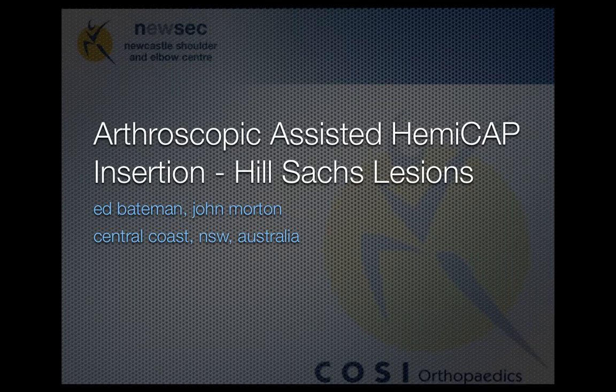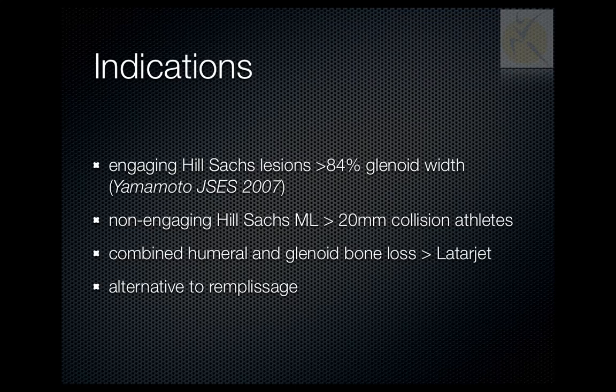Arthroscopic assisted HemiCAP insertion for large engaging Hill-Sachs lesions. The purpose of this project is to assess the use of HemiCAP implants for engaging Hill-Sachs lesions. This has been used as an alternative in our practice for the past 5 years for non-anatomical reconstructions for Hill-Sachs lesions.